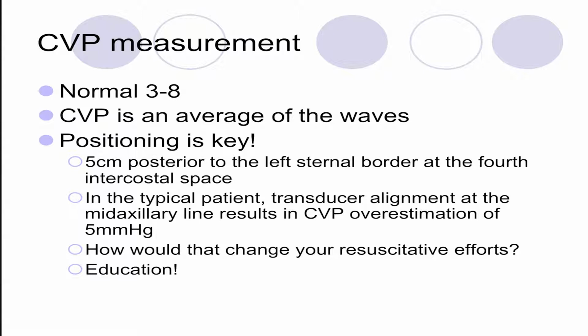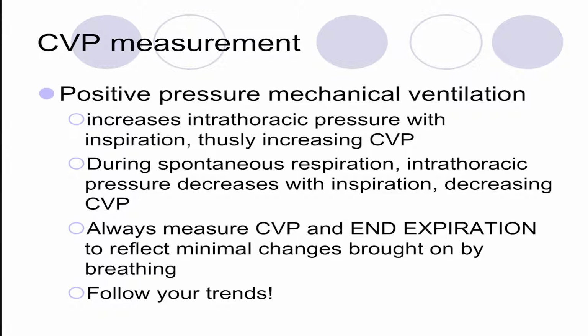So how does that change our resuscitative efforts? Somebody levels between days and nights, or we're not finding the same mark on a patient. I'm going to give fluids because somebody dropped, and you're telling me the trend on the CVP is trending down, when really it's about the transducer. So as you're teaching people to level these, we've got so many new nurses coming in, how important it is to know your landmarks. Not a center point on the middle of a patient's chest, but making sure that new preceptees know where these landmarks are.